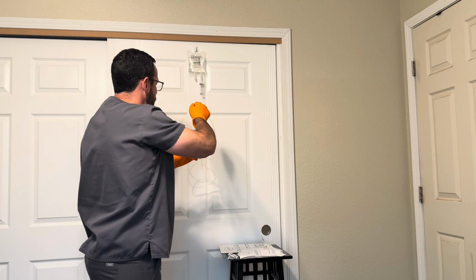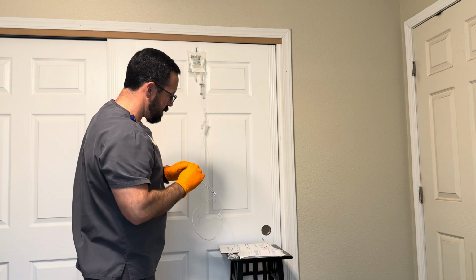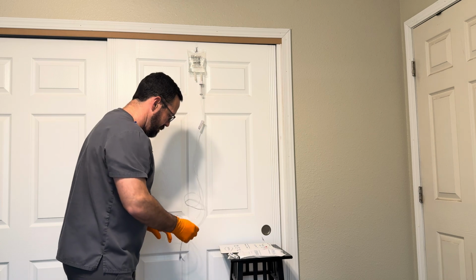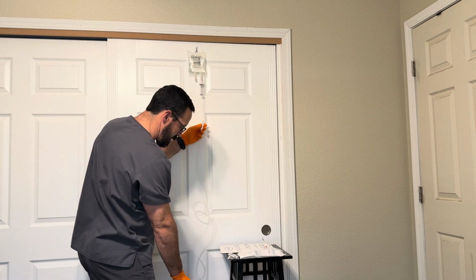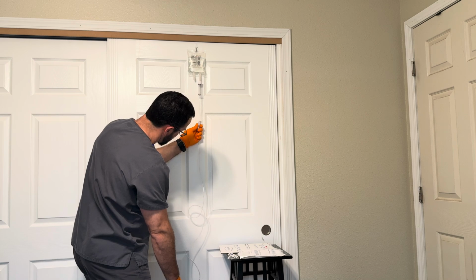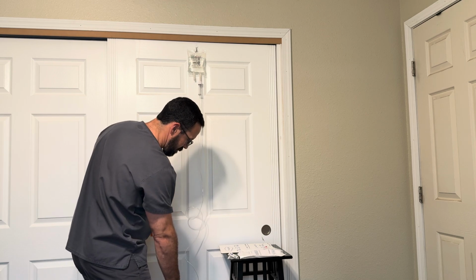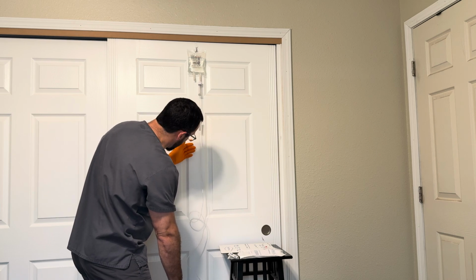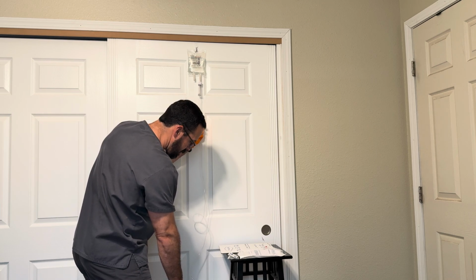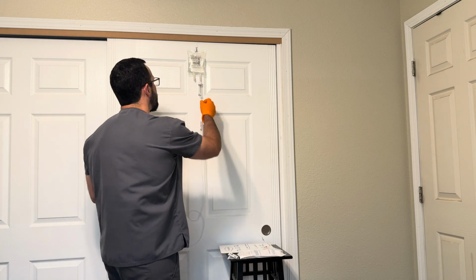I'm going to uncap my connector so I can prime the tubing, and then open my clamp. All right, so we're fully open. Get the air out of the line. Okay, and I've closed it. So let's refill the chamber.